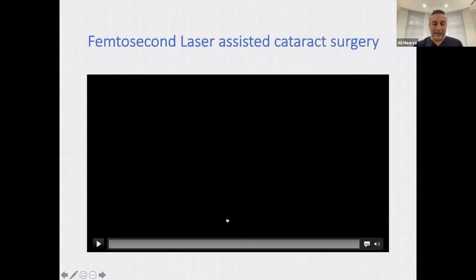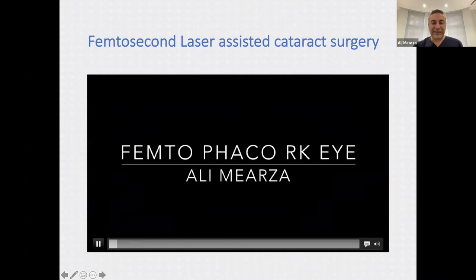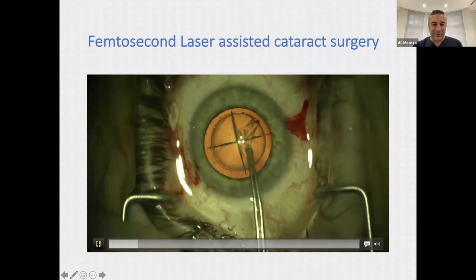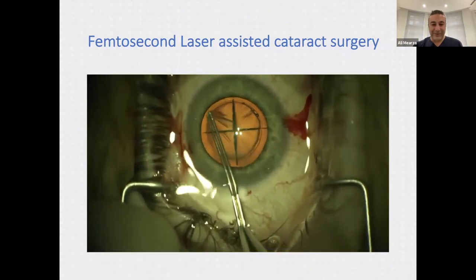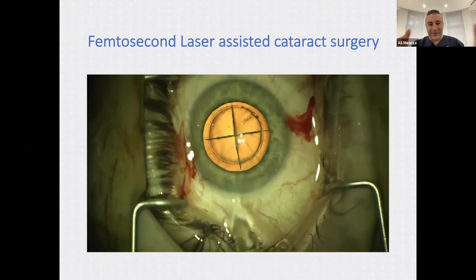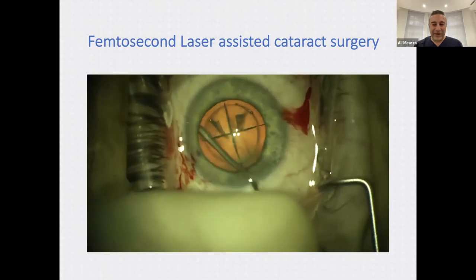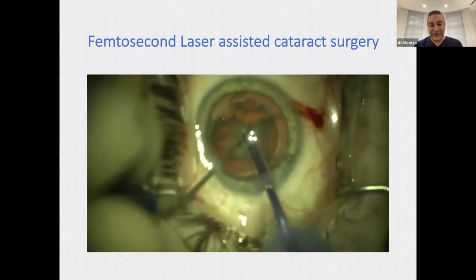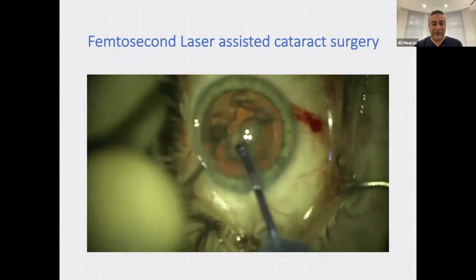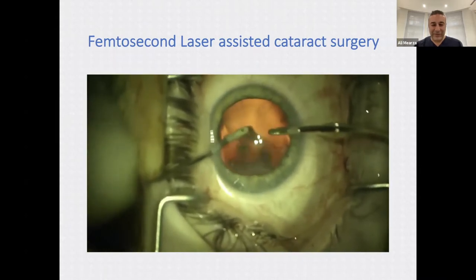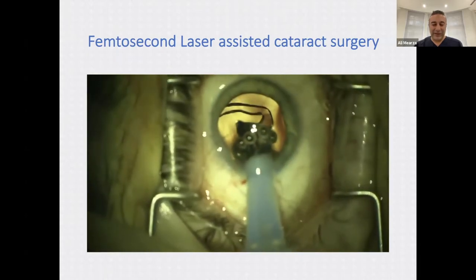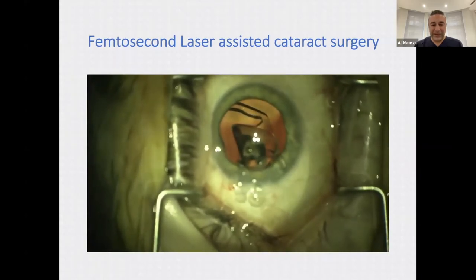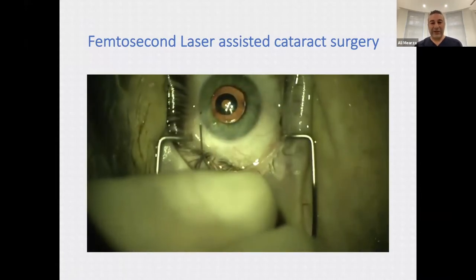In the femtosecond laser-assisted surgery video, the laser has already created a perfect circular opening in the lens capsule and broken the lens into four quadrants before the surgeon reaches the eye. After removing the capsule, the pre-created quadrants are removed using an ultrasound probe with less energy required. In this particular case, an IC8 lens — which has a small pinhole within it — is used for an irregular cornea.